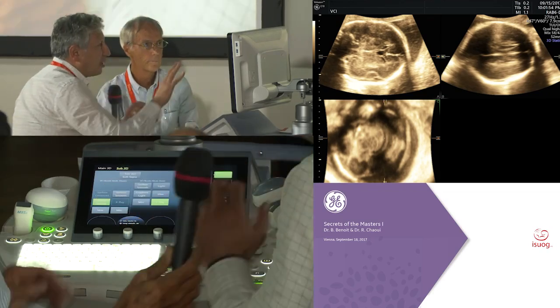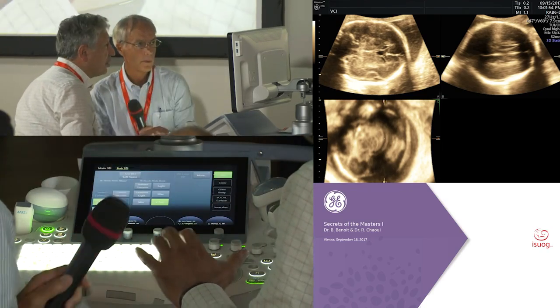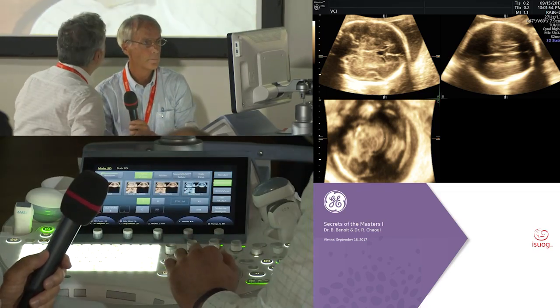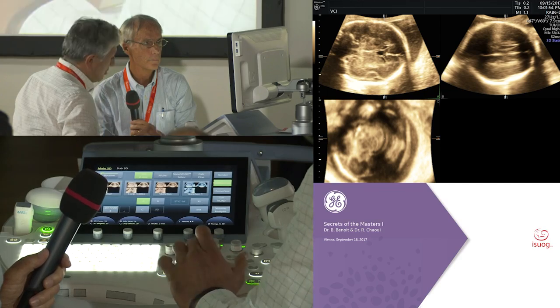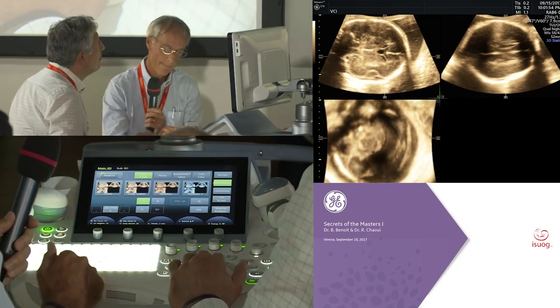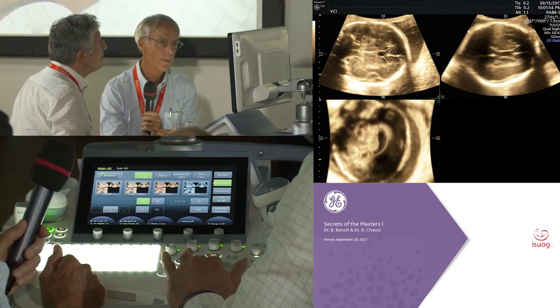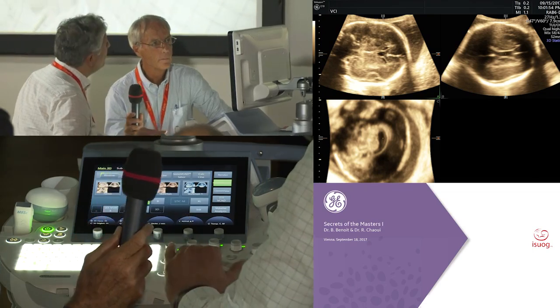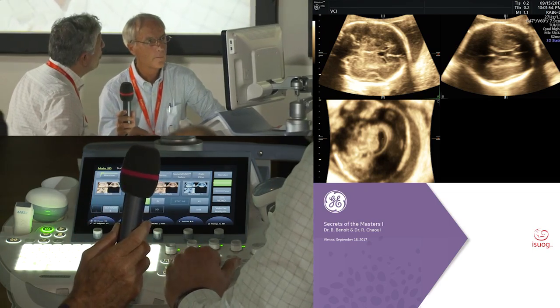Then we go now on the brain. I put first the dot. I choose which plane I want to move. The A plane. I find the dot there. I change the position of the dot to put it here on the cavum septi pellucidi. I will try, well, it's already done here, but try to align this line with the horizontal line.